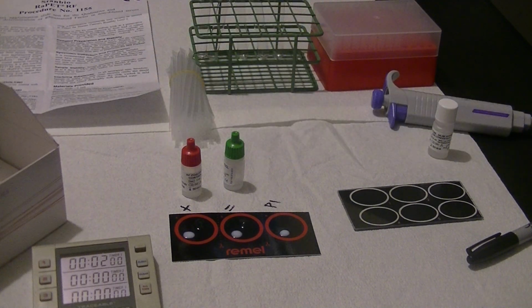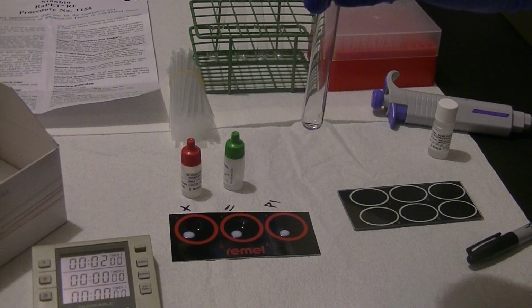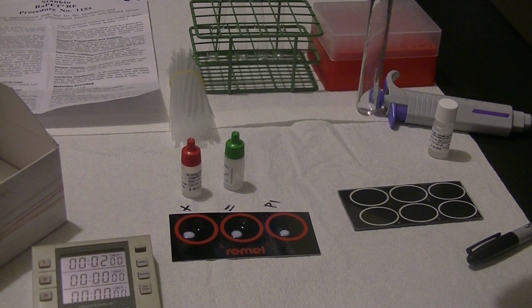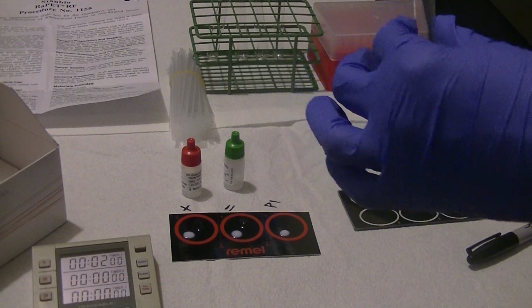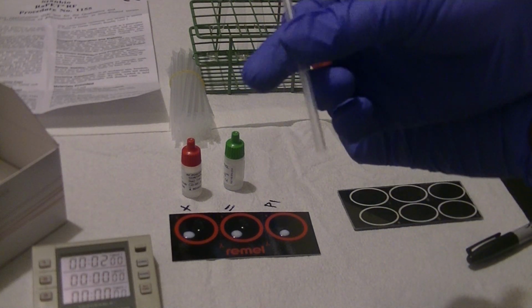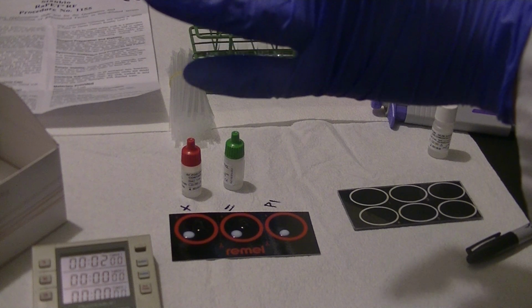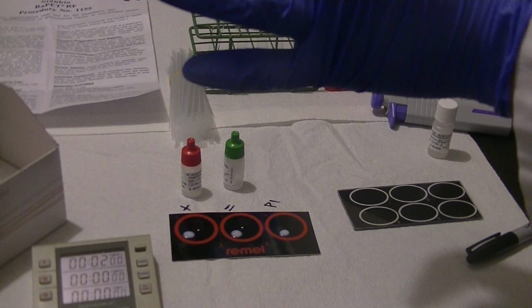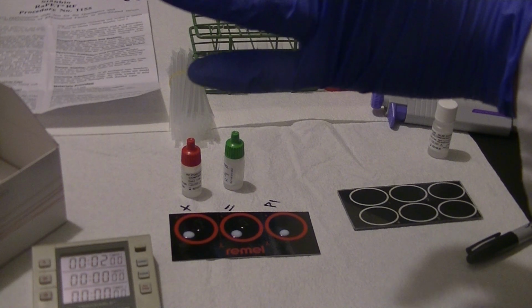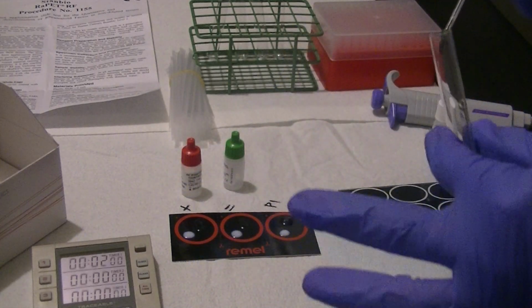Now my patient sample is going to be in a tube. I'm just using a regular glass tube that has some patient sample in it, but normally this sample would be in a serum separator tube or a red top tube where we have collected a blood sample and separated the serum from the blood cells. And so what we use to remove roughly 40 microliters for serology testing are these little sticks that I mentioned last time. If you squeeze it and then place it into the patient sample and release, it sucks up roughly 40 microliters of patient sample, and I'm doing that while avoiding bubbles. And I can place that drop in the reaction circle for patient.